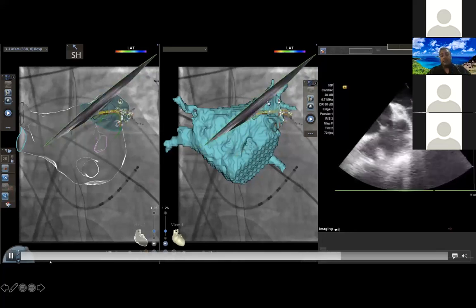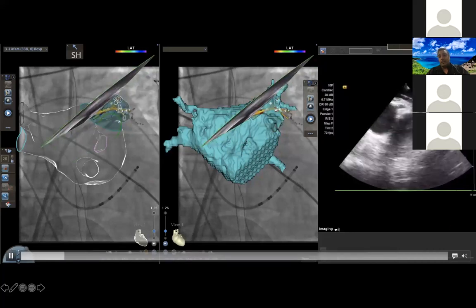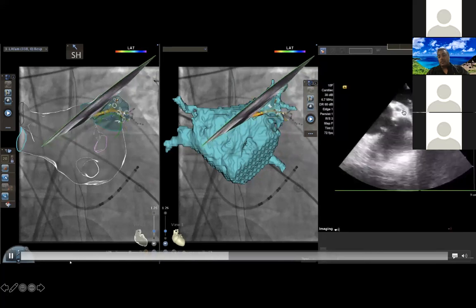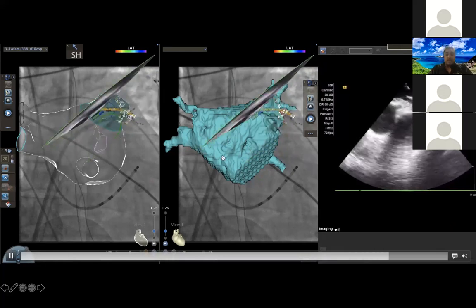But whichever catheter you use, if you get it out into the left PA, you'll be looking down at the appendage. You can see here the beam looking straight down, and on the right you can see a nice view of the appendage, and you can see the circumflex artery coming in and out near the top. So, I don't do this.